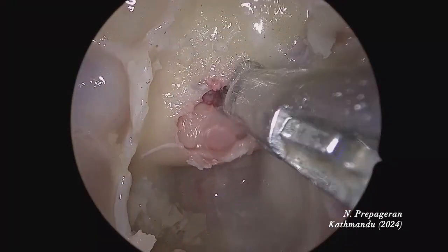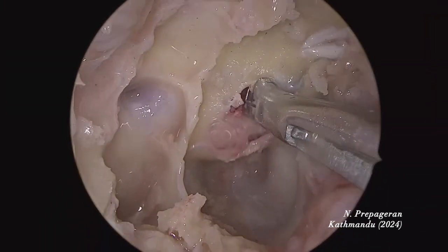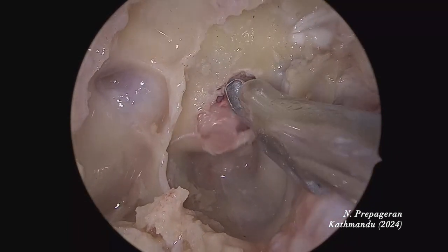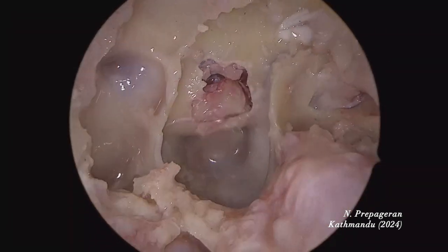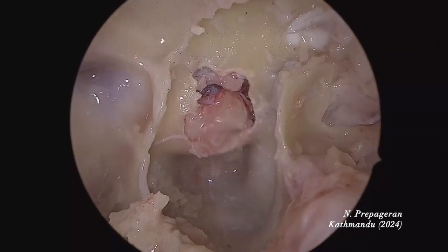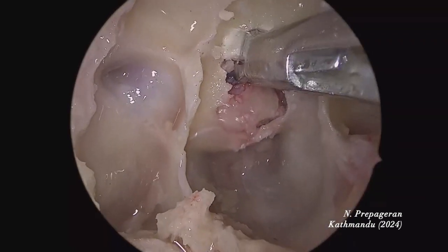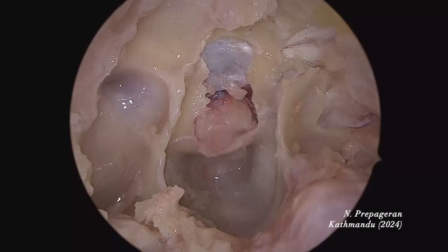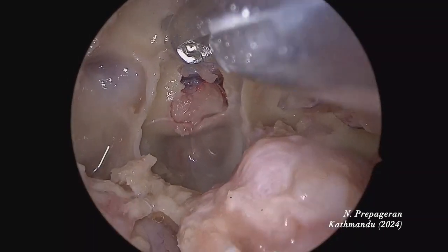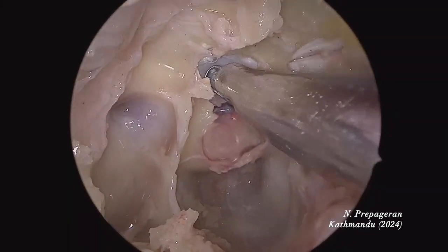I'm going to use a Kerrison punch. Bibo has brought a bigger punch and it's much easier. The dura is almost always stuck in a cadaver, so it's quite difficult to maintain dura during dissection. That's the layer of dura — go between the dura and the bone there. If money is not the issue, please use a burr and drill. If money is the issue, use the burr only to expose dura and then use a Kerrison punch.